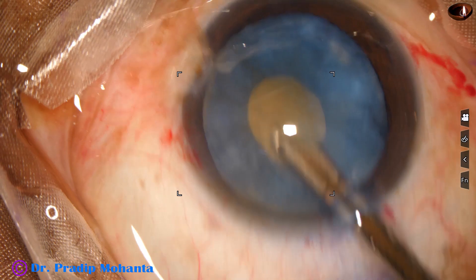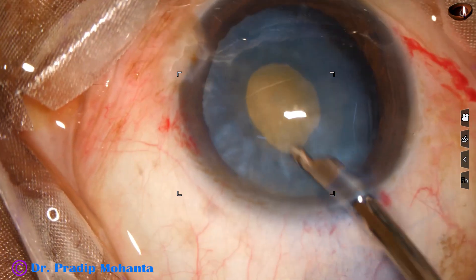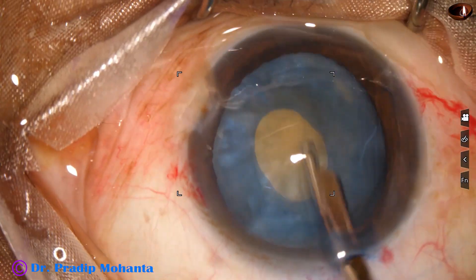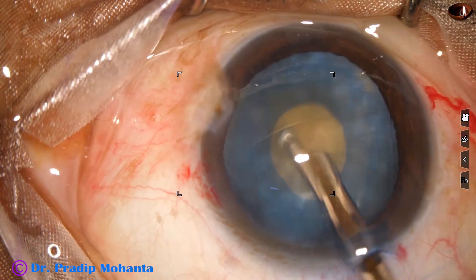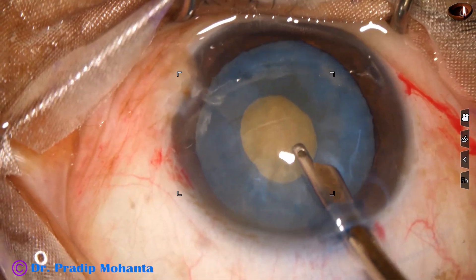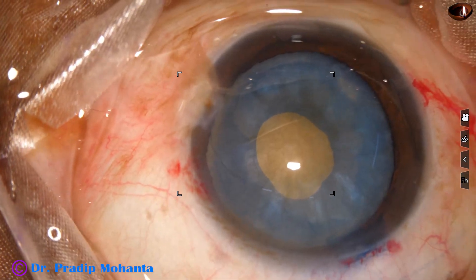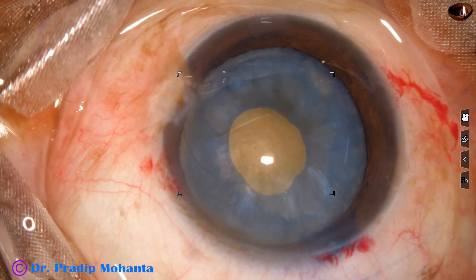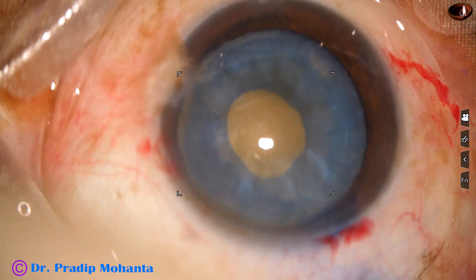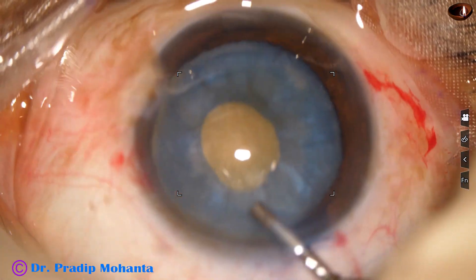Now I use a Simcoe cannula and remove some cortical lens matter. I rotate the nucleus and in this way the cortical matter from all around is removed, so the intralenticular pressure is drastically reduced.